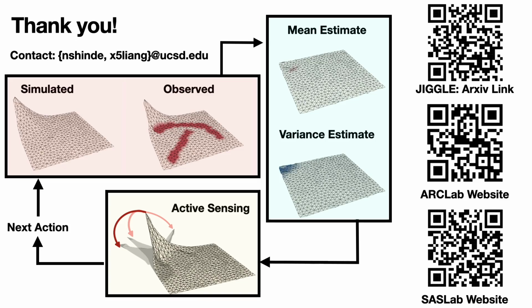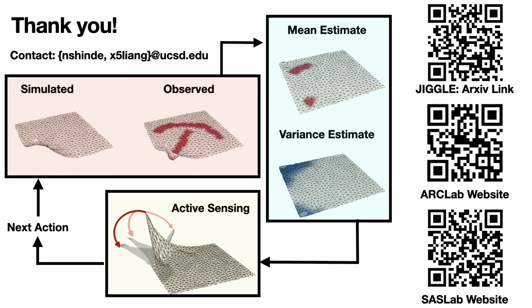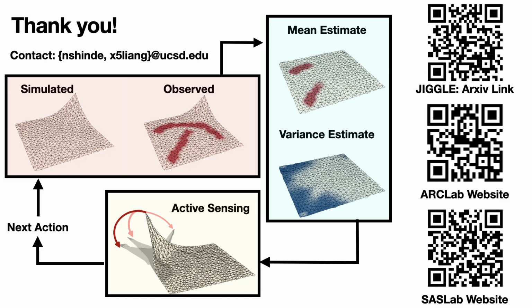As a summary, we present JIGGLE. Our approach leveraged the differentiability of PBD simulators with an extended Kalman filter to estimate boundary parameters, which we used to generate an optimization-based entropy minimization strategy.